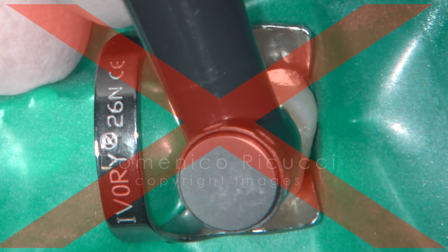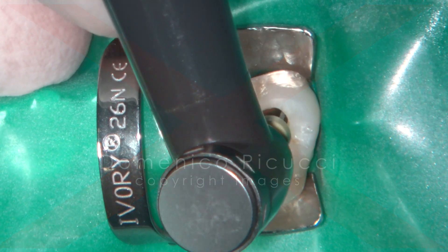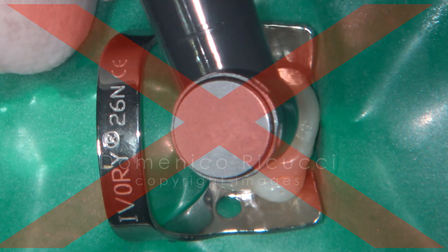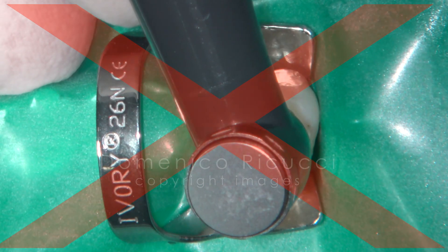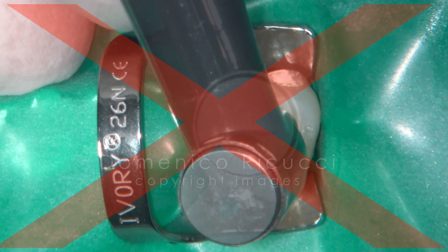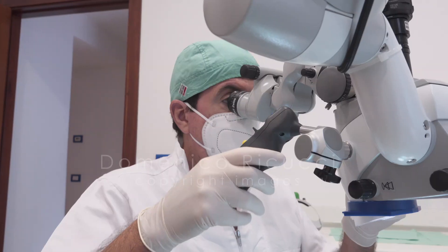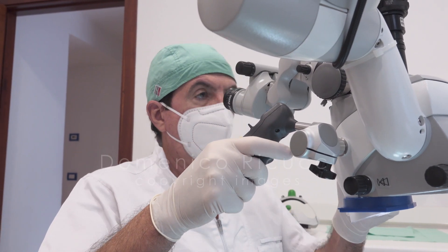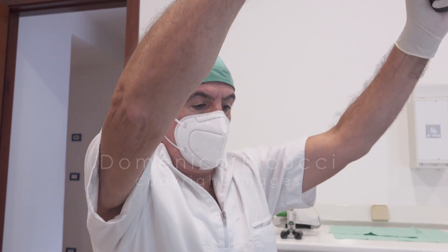Do not work watching in the mirror and the microscope while introducing rotary instruments in the canals. You cannot see the reference point. The microscope is no longer necessary at this point.